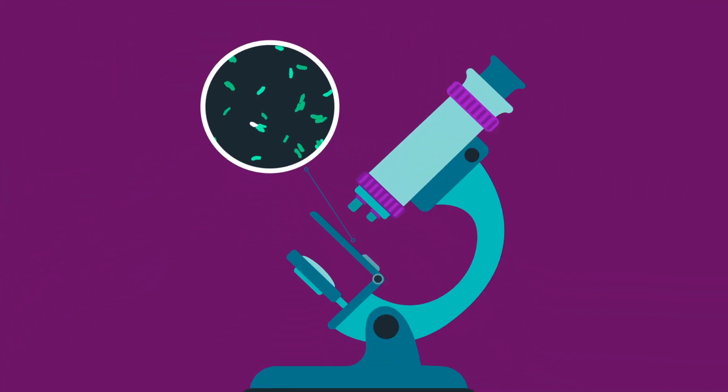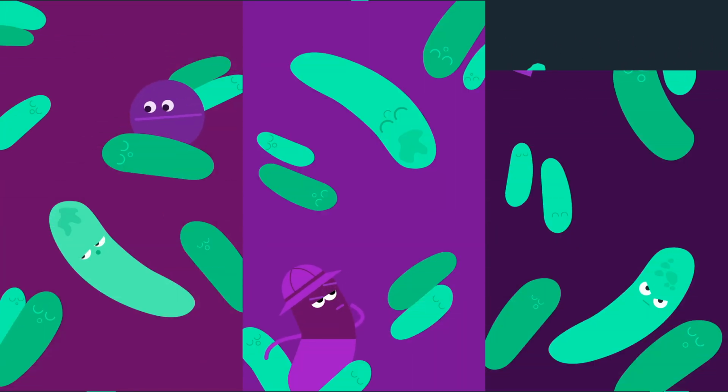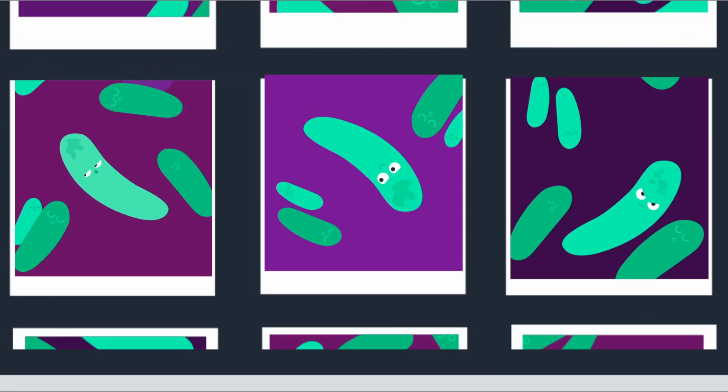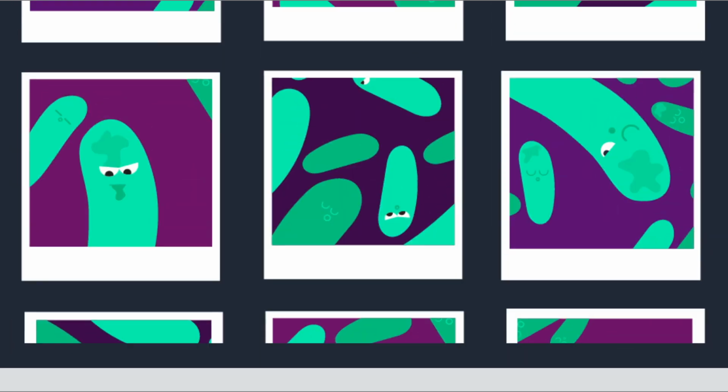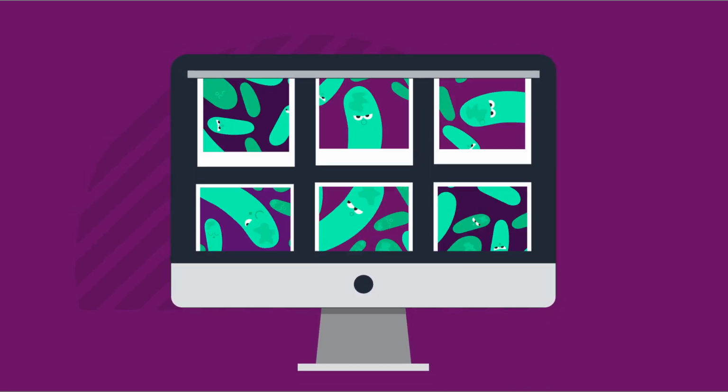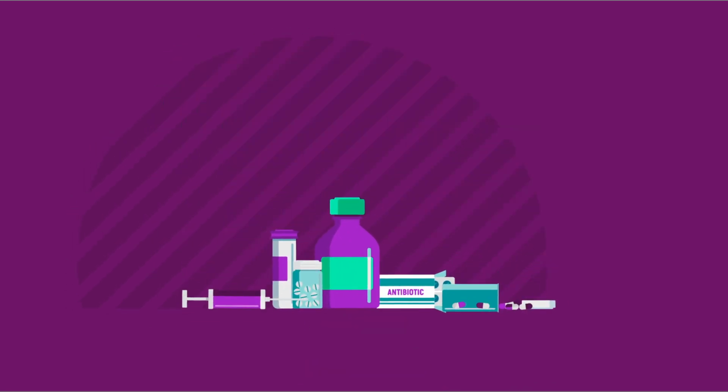The test has three parts. One is taking the sample, processing it to get rid of the gunky components which might cause problems with the imaging of the microscope. The bacteria that get harvested from the sample then get looked at under the microscope, and we can look at how the cells change in the presence of different antibiotics. And then there's a computer algorithm which processes all the images taken of thousands of bacterial cells and helps us understand whether or not we can go ahead with treatment.